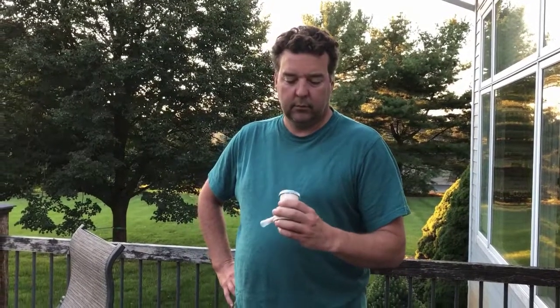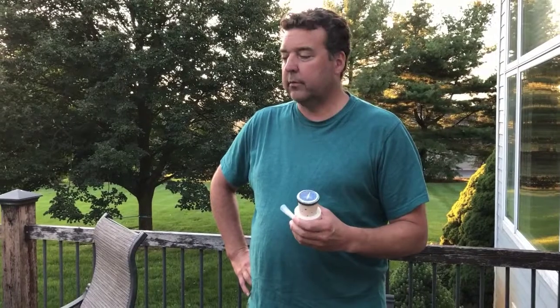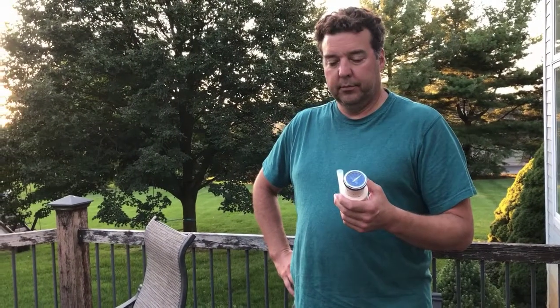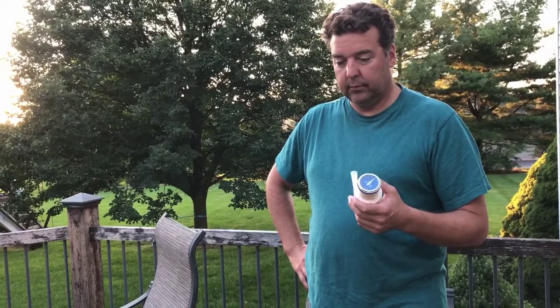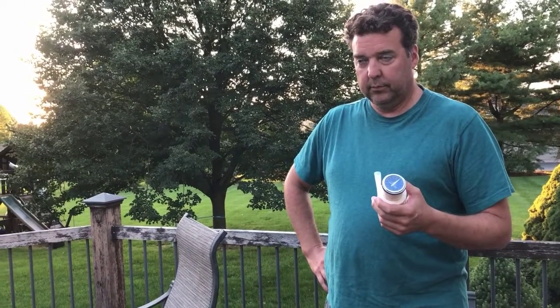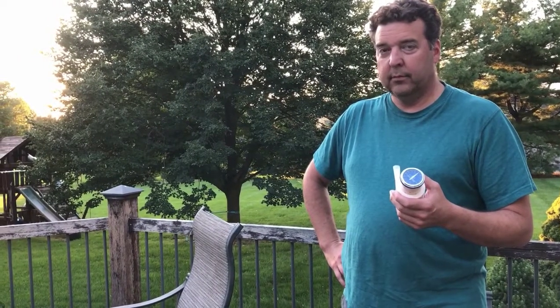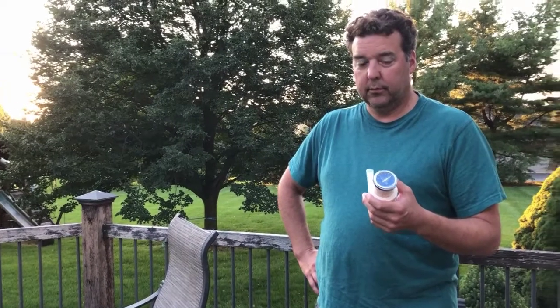Okay, so now Chris has had a few minutes to relax and bring his breathing back to normal. And we're going to do vital capacity. And remember, vital capacity is you take the biggest breath in that you possibly can and put the spirometer in your mouth and then blow out as much and as hard as you possibly can. You might want to bend over and crunch your stomach muscles, because remember, when your stomach muscles tighten, it pushes the abdominal contents up against and underneath the diaphragm, pushing the diaphragm up, squishing the lungs, raising the pressure in the lungs, which forces air out.